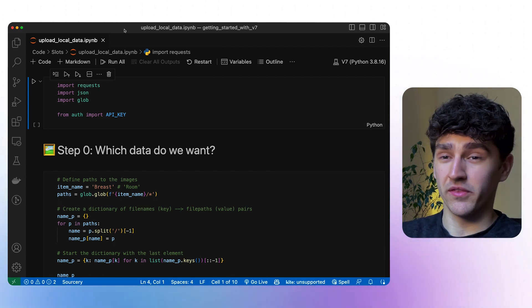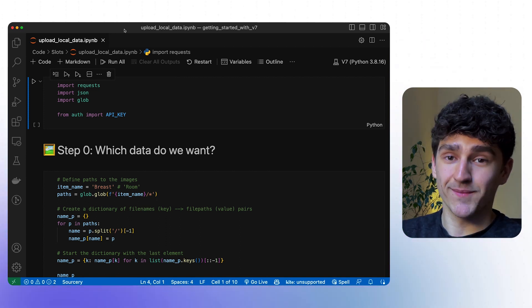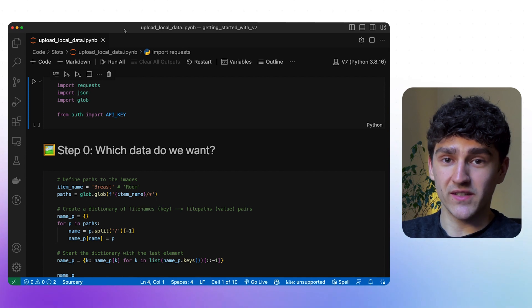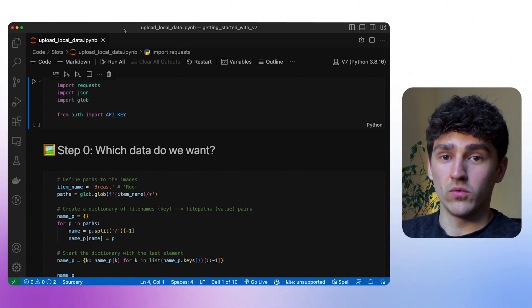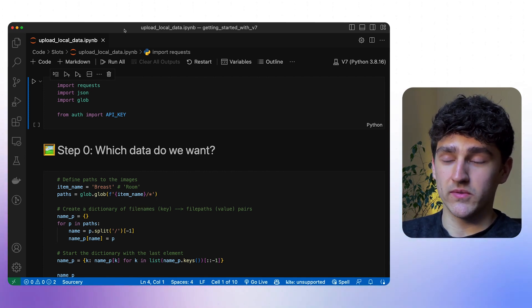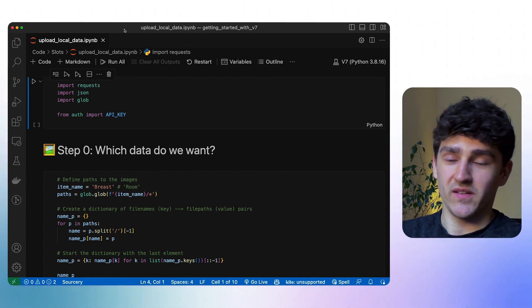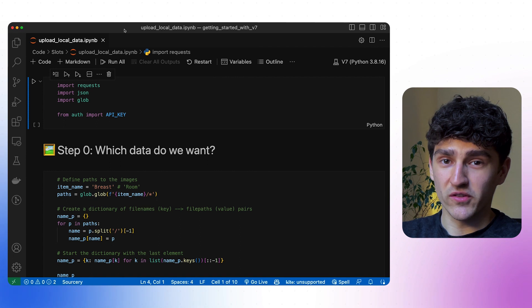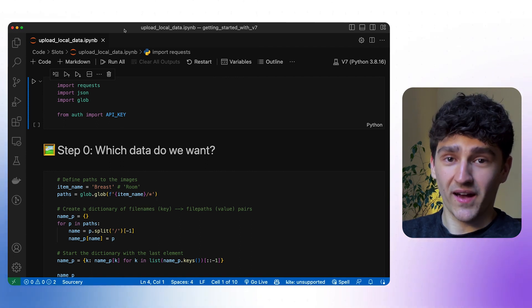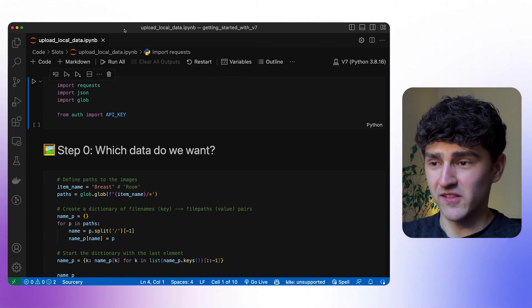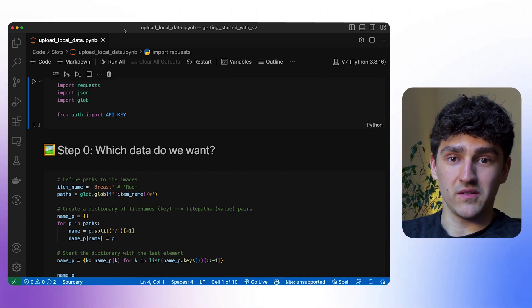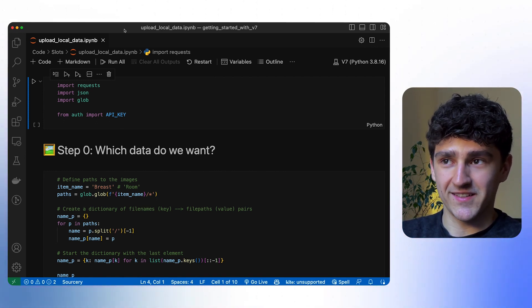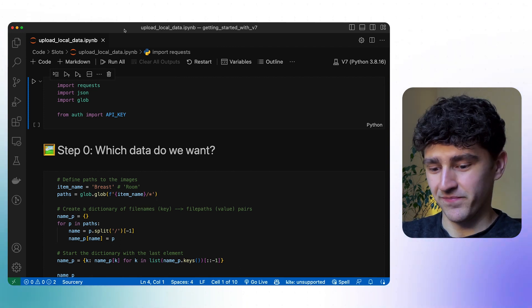We'll start with the imports. Since we are using the REST API, the only library we really need is the requests library. I'm also importing my API key here, which I have stored in a separate file so you don't see what my API key actually is.